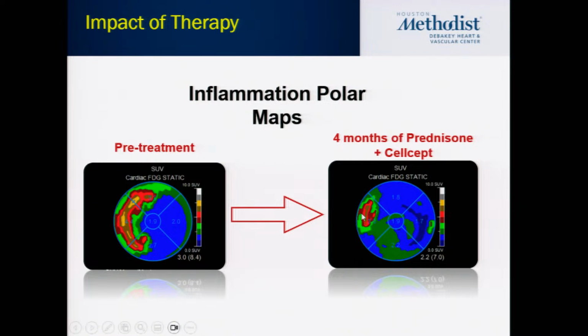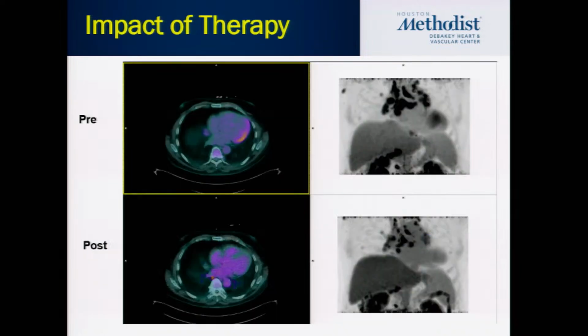For example, this patient has significant improvement, but there is some residual activity there, and it's usually referred to the treating physician to decide how much to continue, intensify, or decrease the intensity of their medical therapy.